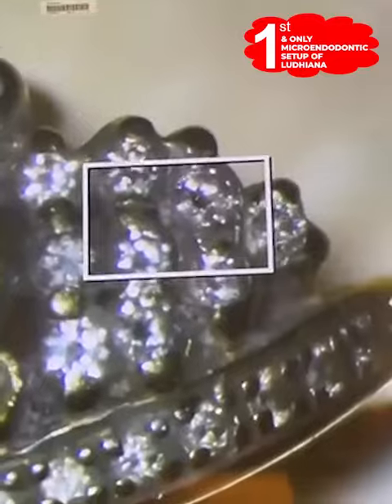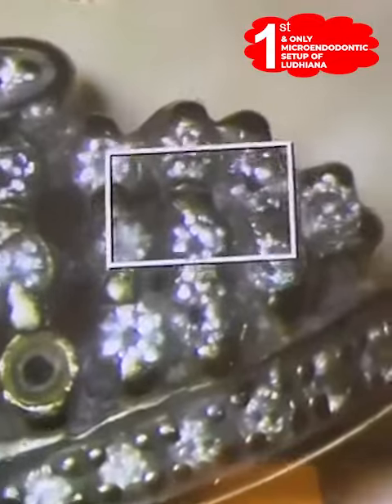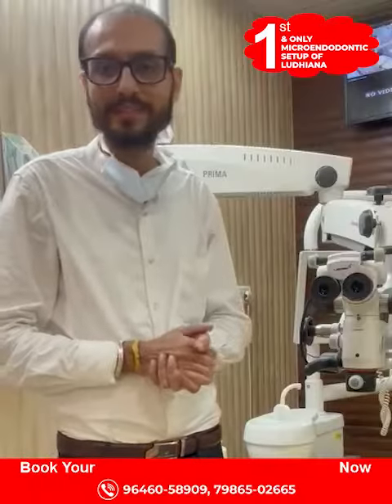The same is the condition of the tooth. I can work with this magnification on the simplest carious lesion, and I can avoid touching the natural tooth structure and save the enamel. So this was a dental microscope.